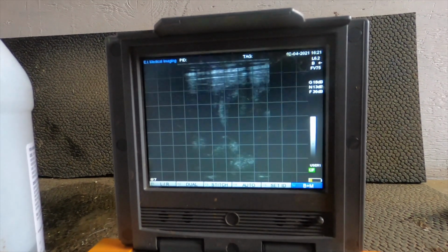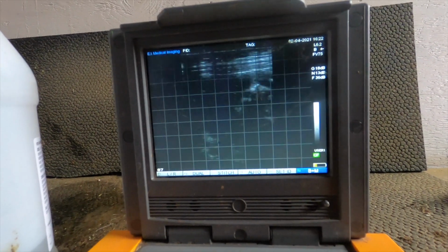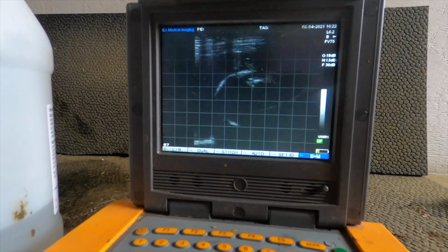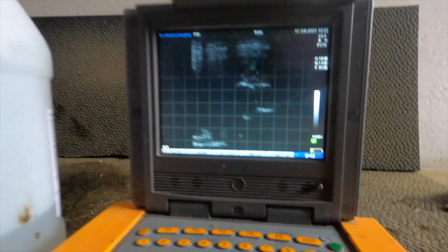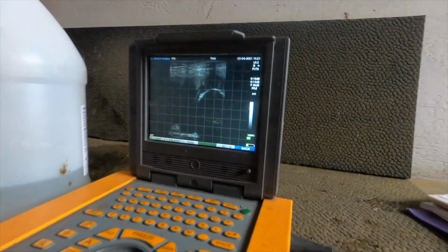This kid is substantially bigger. Okay. That's our skull right there. Okay, yeah. Much bigger than the other ones, isn't it? Yeah, it is substantial. Will you poke the freeze button for me? Right there. Perfect. Good job.